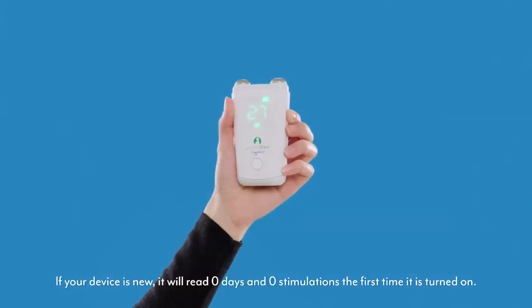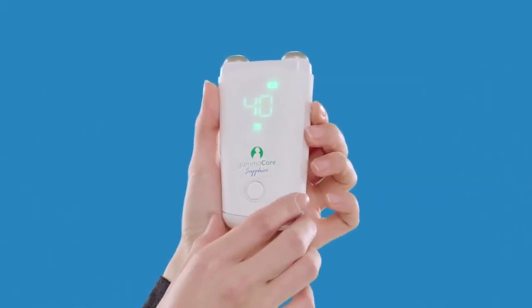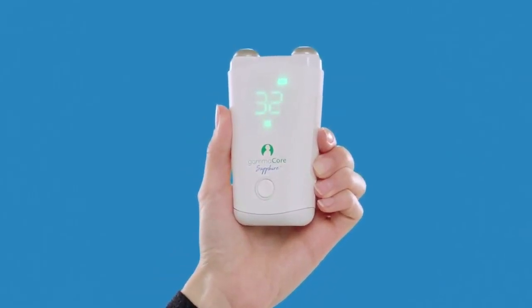When you adjust the intensity, the display shows the intensity level, which ranges from 0 to 40. The top of the control button increases the intensity of the stimulation. The bottom of the control button decreases the intensity of the stimulation. You will learn more about these controls later.